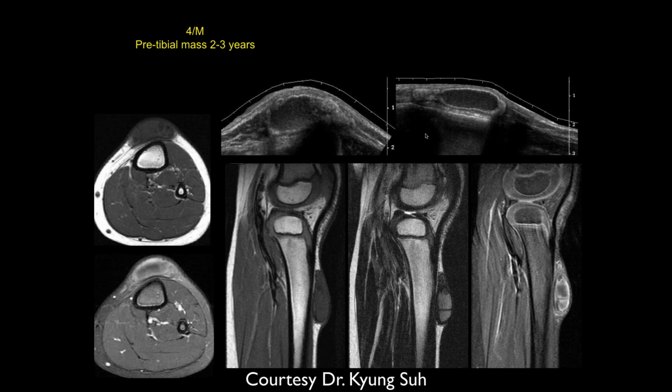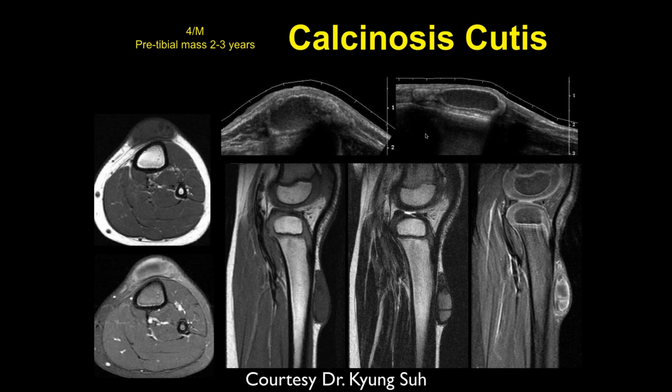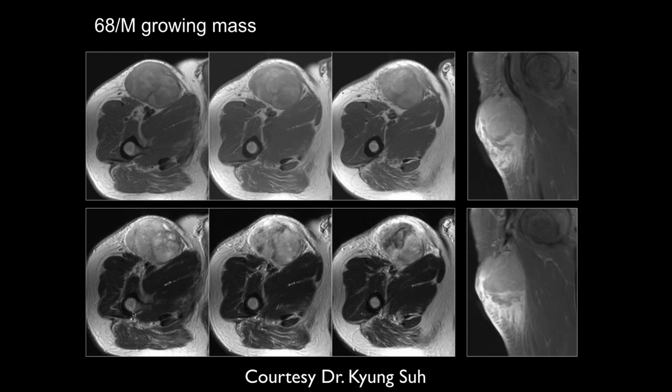If they're calcified, what kind of image is that on the right? This is a T1 fat sat post contrast. But I thought calcium would be black all around. Well, I think there are areas that are probably calcified within it, but this also has a lot of soft tissue with it, which is probably showing some peripheral enhancement. I got it. Okay, I just wondered.